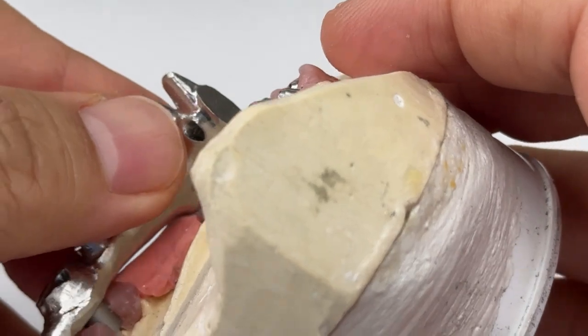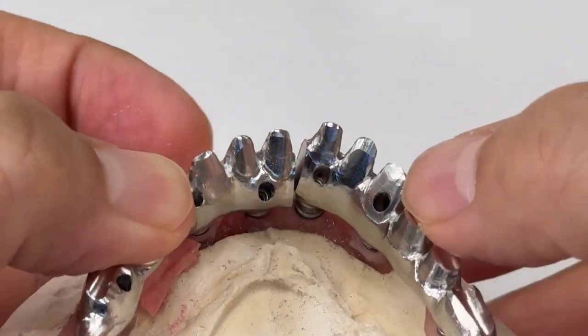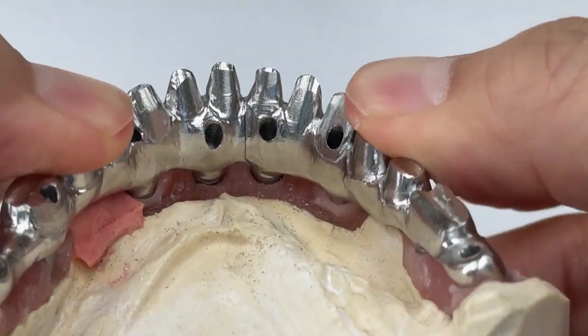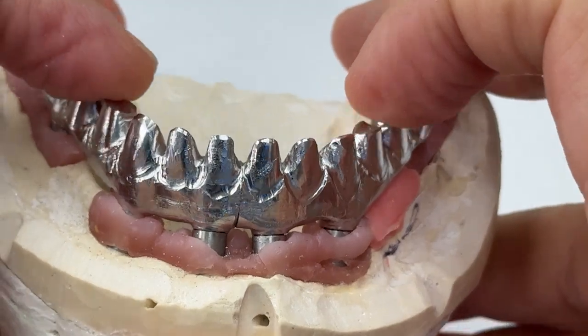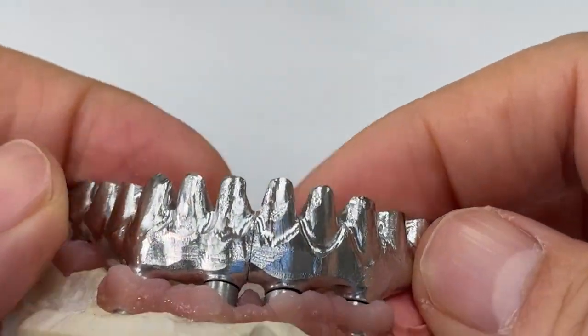And now we're going to do the welding in between the teeth, which is crimped over, like this. So the metal finish is good. Now it's the welder ring.